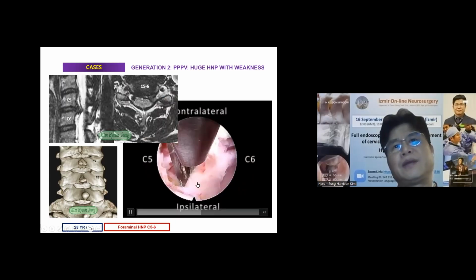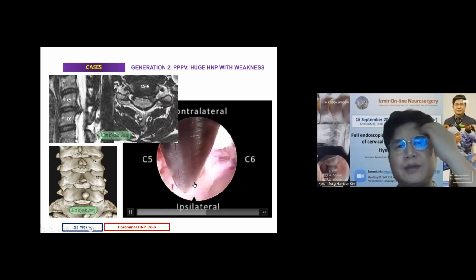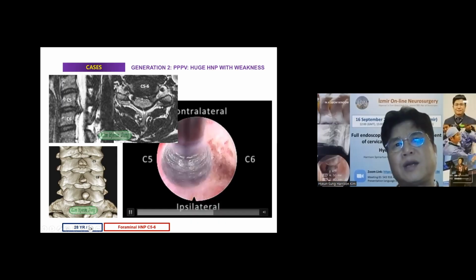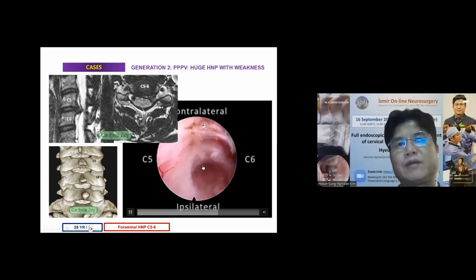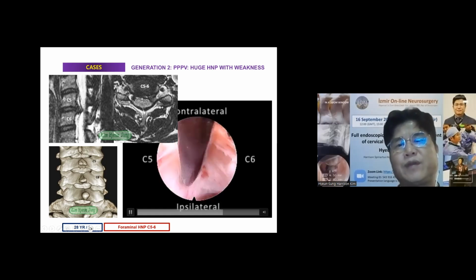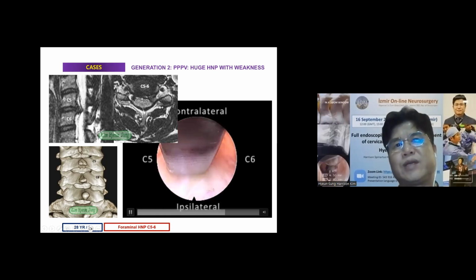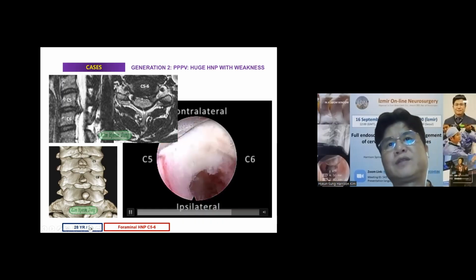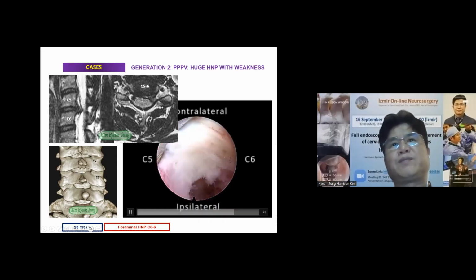Then some foraminal ligament resection. Then you can see the partial pediculotomy and vertebrotomy image. You can see cortical, cancellous and cortical pedicle area. After then, we can retract more safely from the caudal to the cranial. And then insert the working channel and traction is possible.